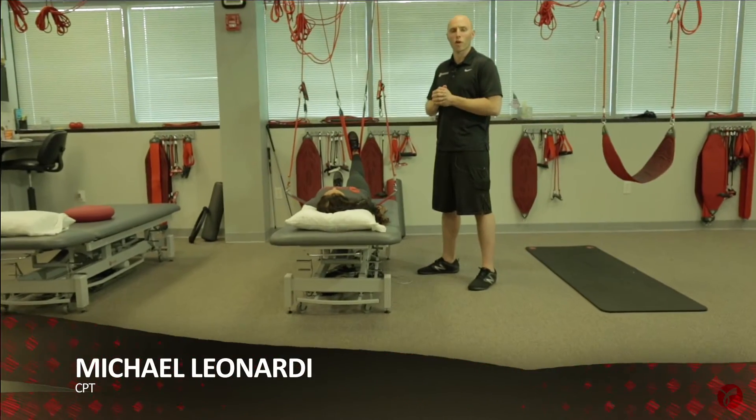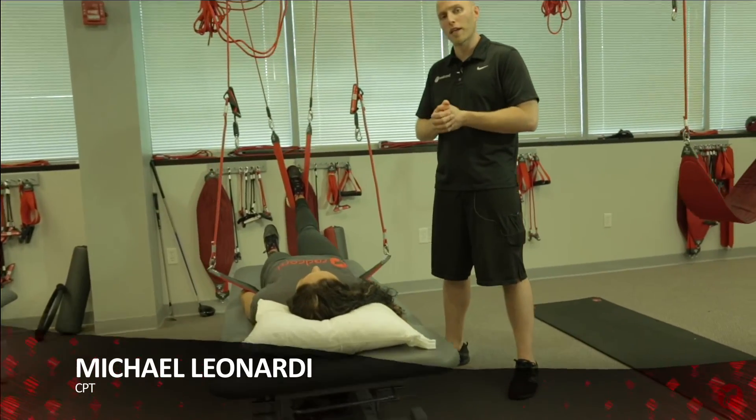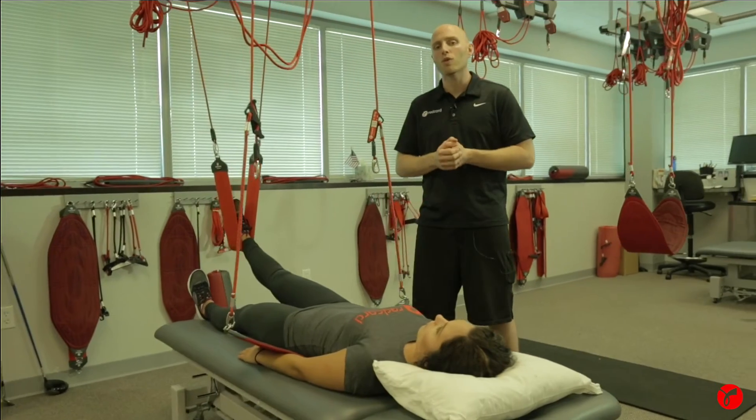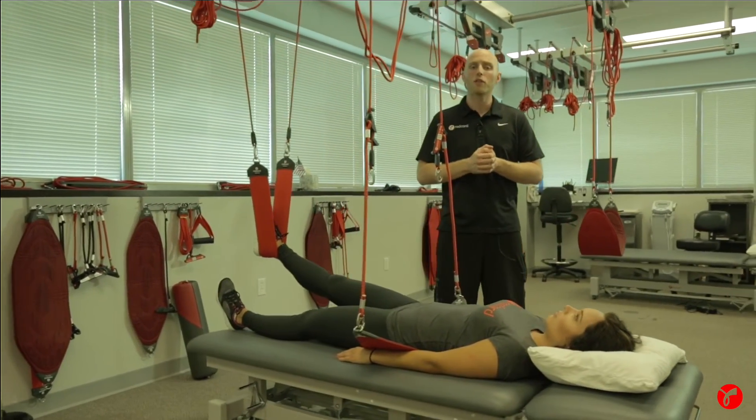Hey guys, this is Mike Leonardi from the Nurak Institute in Red Cord USA. This week's Red Cord Educational Series is focused on the Red Cord Bungies and how they can be used in various capacities for rehabilitation, fitness, and sports performance.